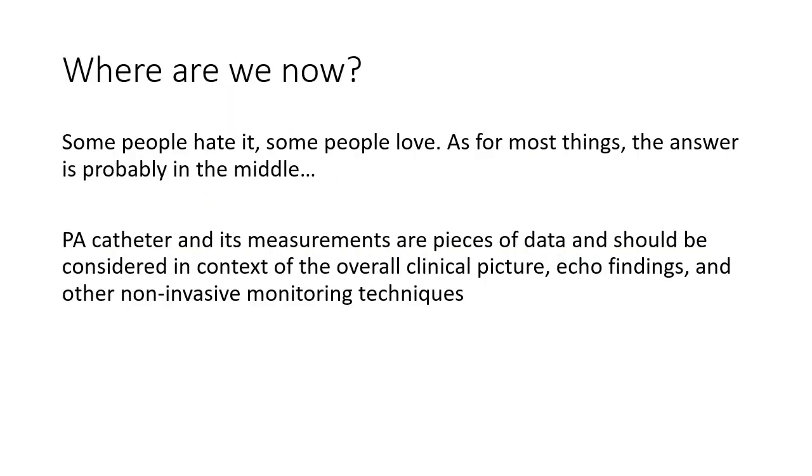I think some people will always hate the PA catheter, and some people are going to absolutely love it. As for most things, the answer is probably in the middle. The PA catheter and its measurements are pieces of data, and they should be considered in the context of the overall clinical picture, echo findings, and other non-invasive monitoring techniques.